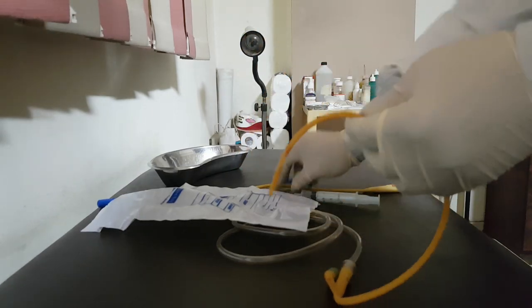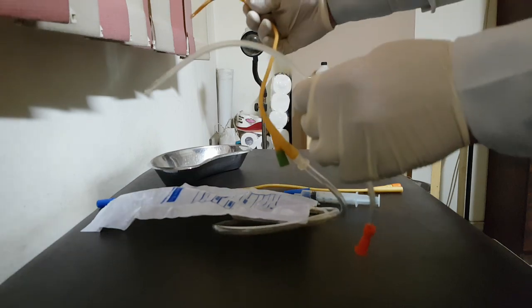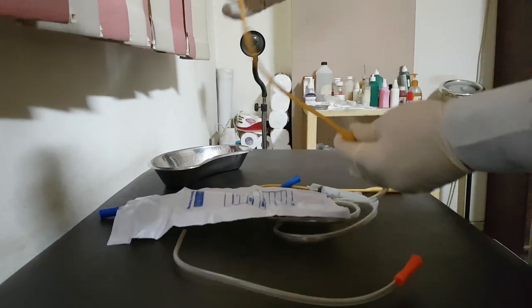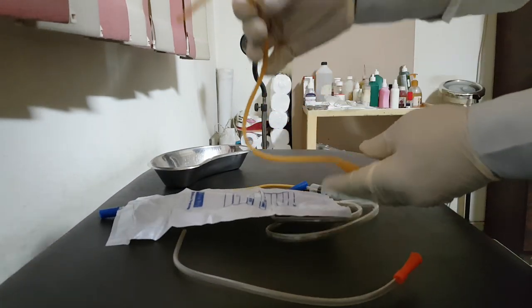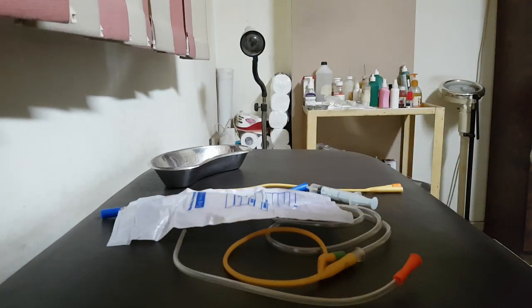So today we have two examples of catheters: the intermittent catheter, Nelaton catheter, and the indwelling catheter which is Foley catheter. I hope it was clear enough. Thank you everybody. My best wishes for all of you.